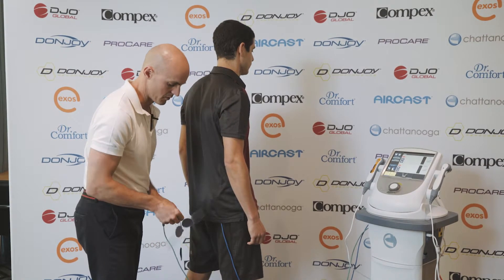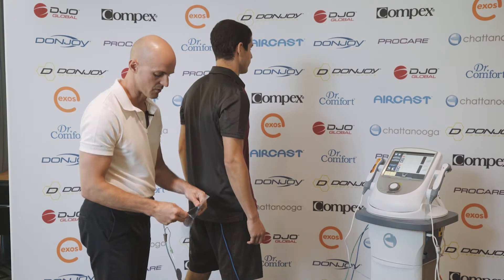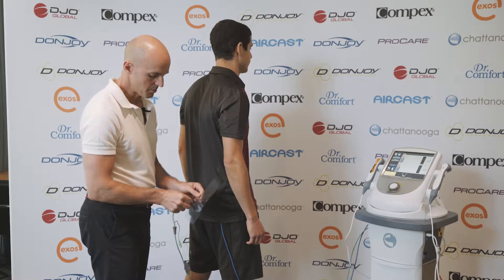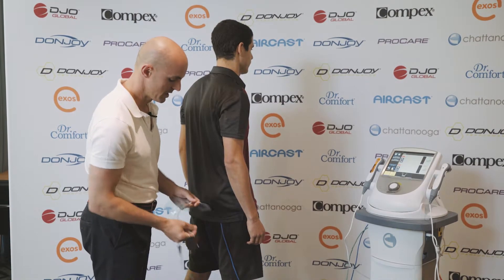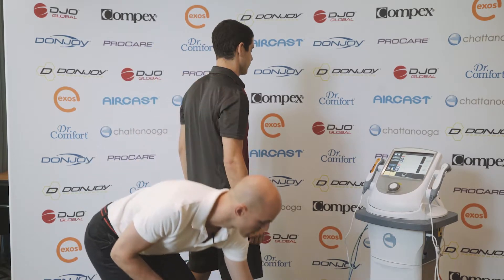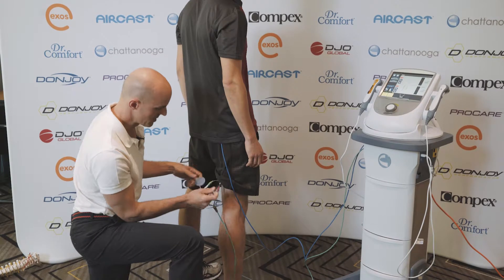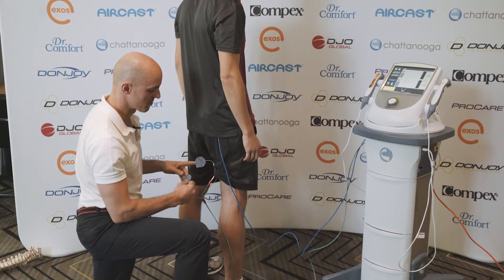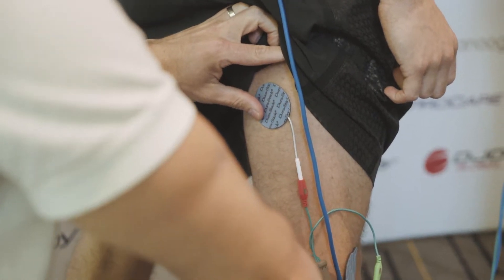Twice as much effort should happen in the glute versus the hamstring, and the hamstring gives us an indication of what the whole lower leg's doing. People that have classically had a history of knee problems or low back problems tend to rely a lot more on activity through the lower leg rather than driving out of the glute. There wouldn't be too many people that come to me with low back and knee problems that don't find themselves working on refining their glute activation patterns.